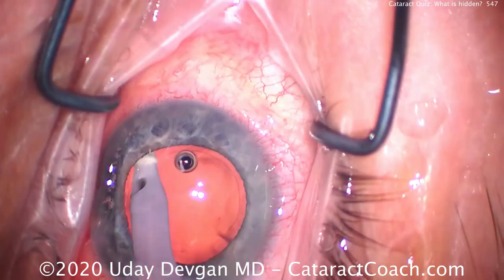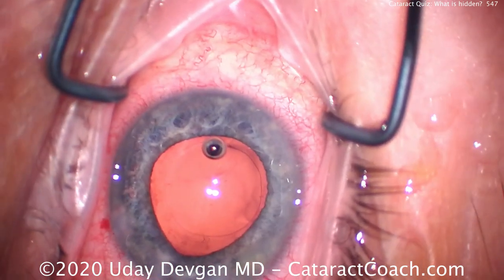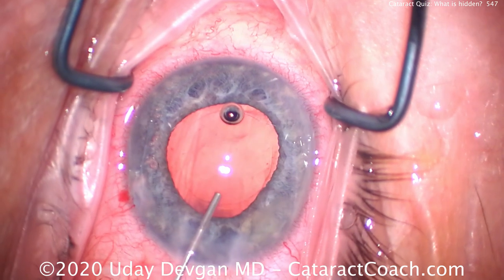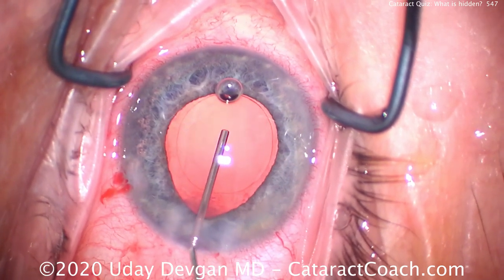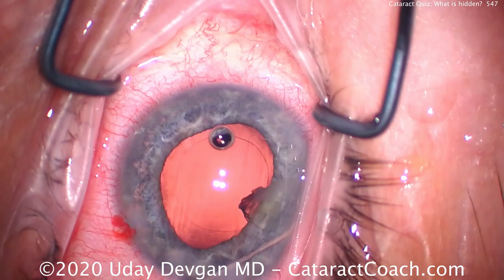Similarly, doing cortex removal — especially with a smaller pupil — I want to make sure we're not going to leave any cortex behind. As I strip the cortex 360 degrees from the capsular bag, in my mind I'm thinking: okay, make sure there's nothing left, maybe I didn't get that one quadrant. So here at the end, when I fill the capsular bag with our cohesive viscoelastic, I'll inject a little bit more to fill in the bag.